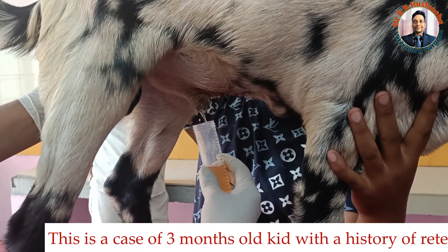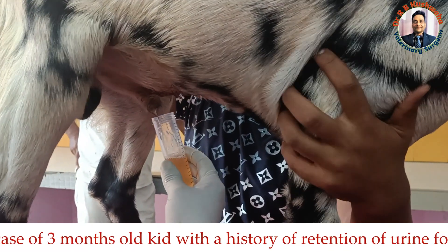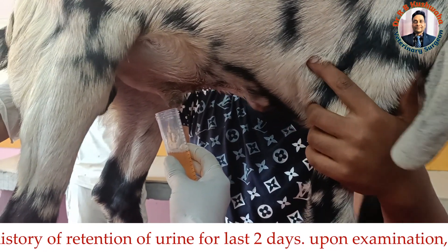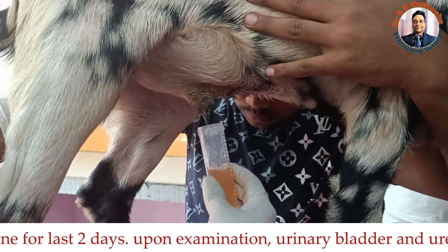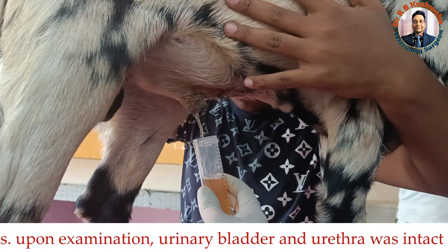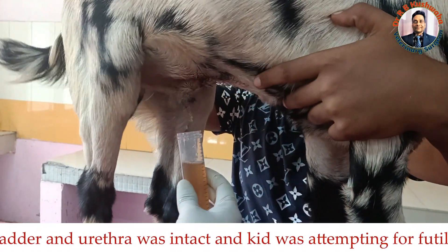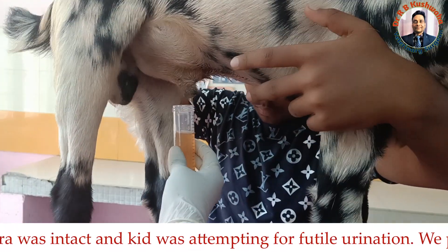Sometimes if urine is not coming freely, what you do is just massage the urethra, particularly in the post-scrotal region, as I am doing here. If you massage, the urine flow definitely increases. In this way, there is no need to go for tube cystotomy.